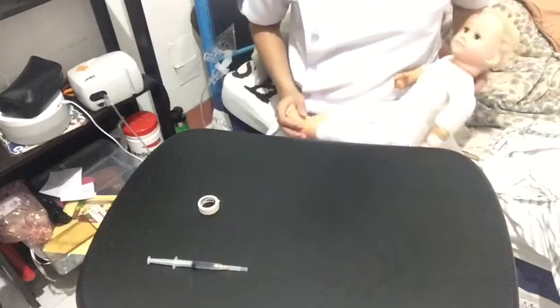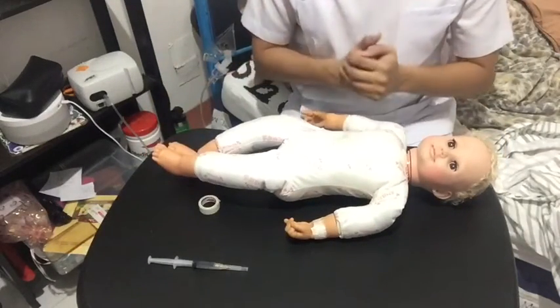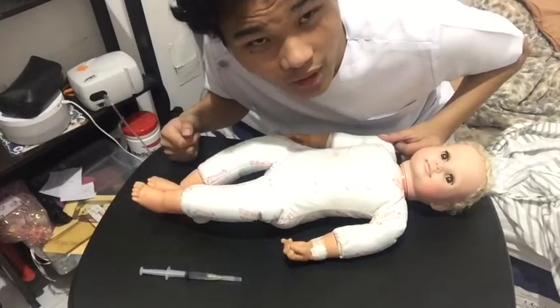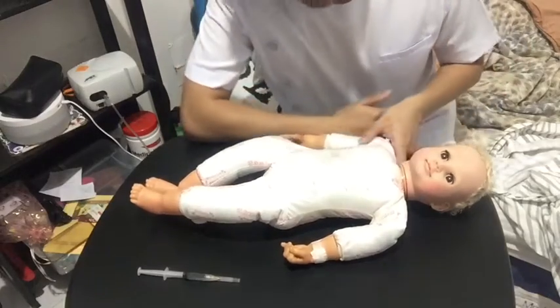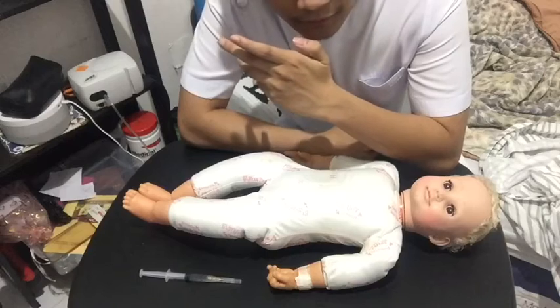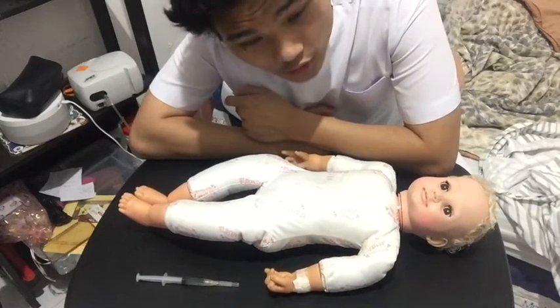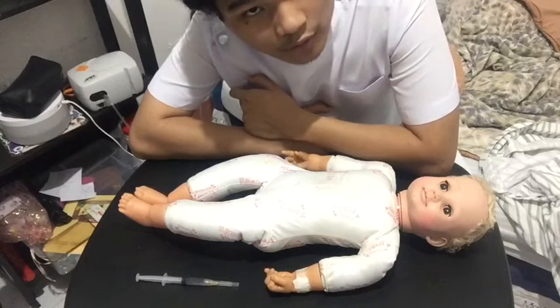Now, after placing the client in a comfortable position, we're going to be teaching the client how to breathe properly while using the nebulizer. The proper breathing technique is to inhale deeply through the mouth, hold it for a few seconds, and then exhale through the mouth.